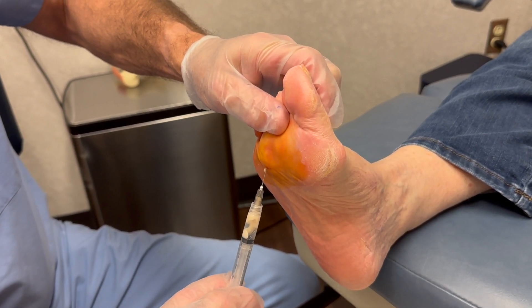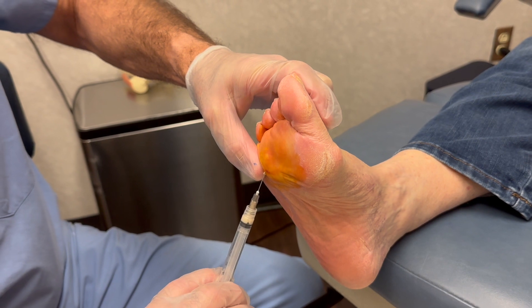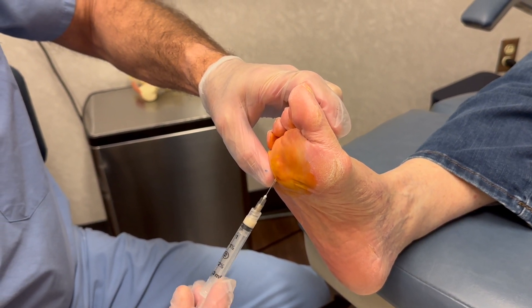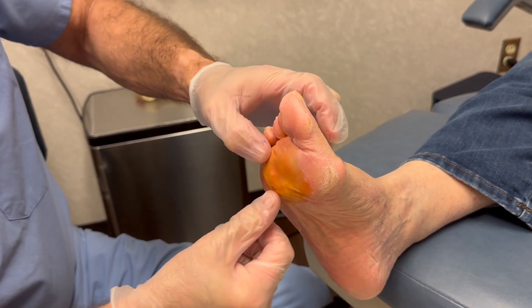There are very few vessels in this area — very few veins and arteries. Notice when I inject I'm doing something called aspirating, making sure I don't inject this into a vessel. But overall, a very safe area.